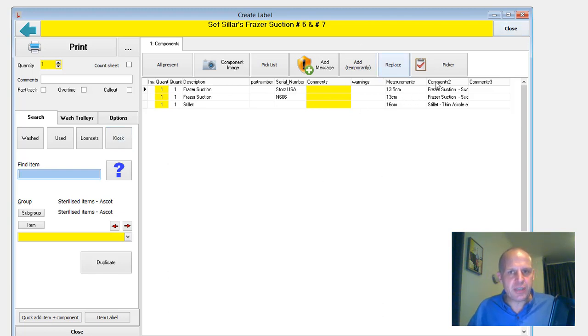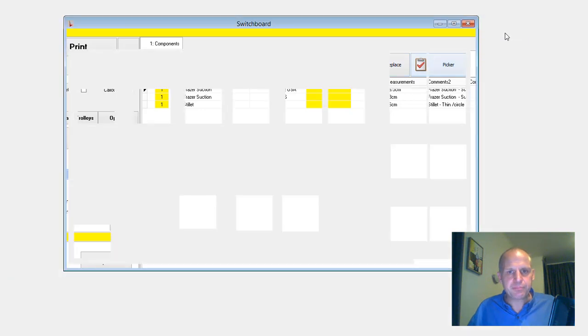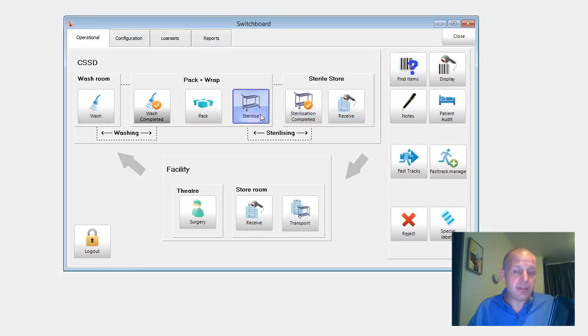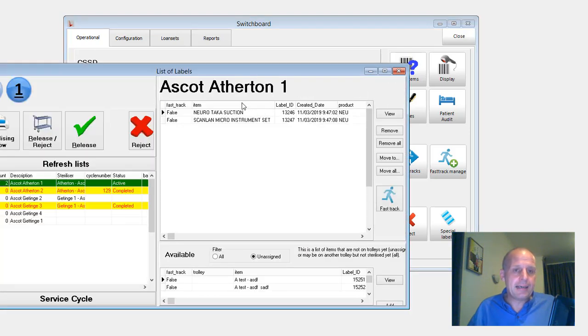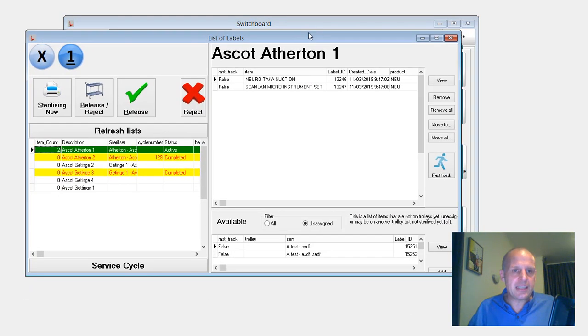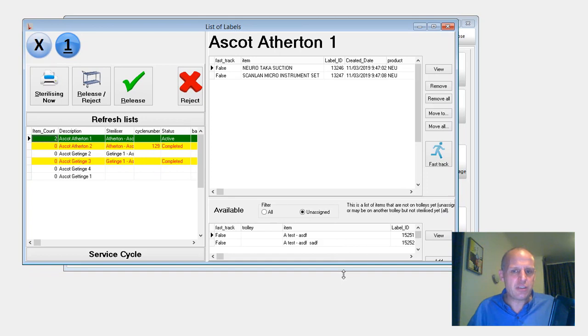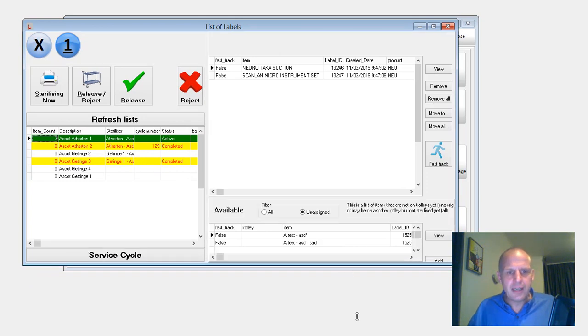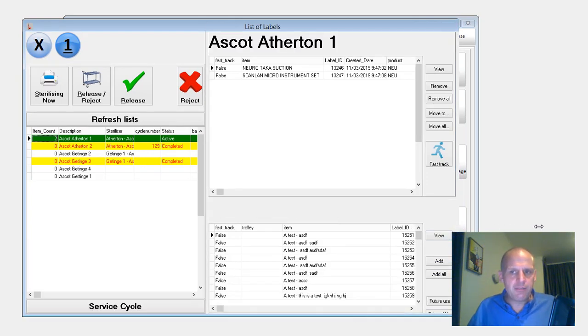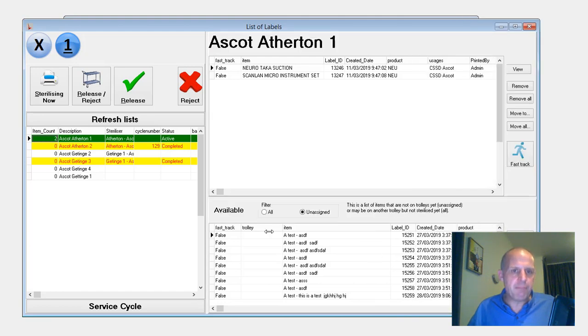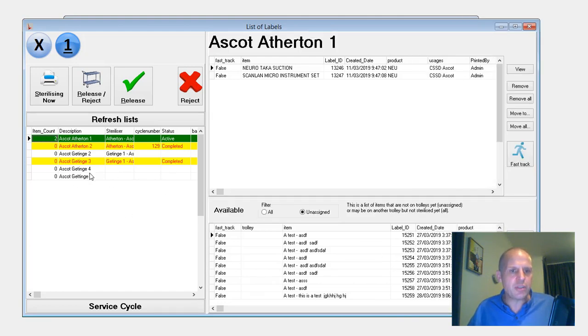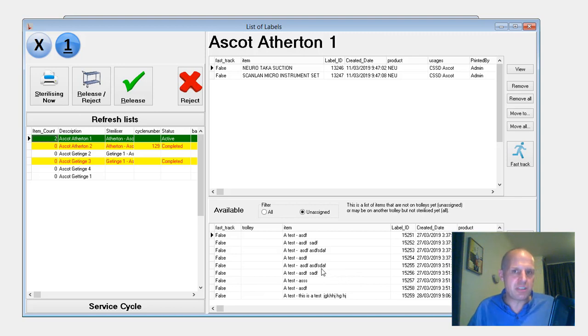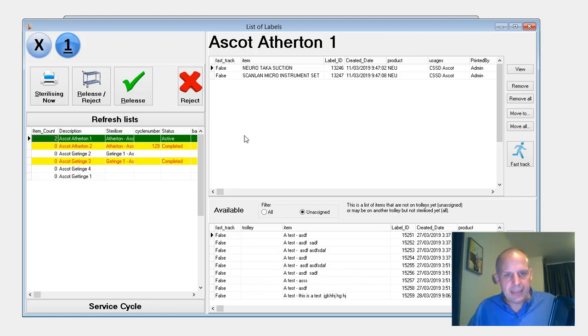Okay, so that's the create label. The next screen that's changed, sterilisation screen. For St George, it's pretty similar to what you've got. Whereas Timaru, further behind, it's going to be a major change for you. So here's a list of all your trolleys. Here's the items that are on the trolley. Here's all the items that have been packed, but not sterilised and not put on a trolley. So that's the basic layer.